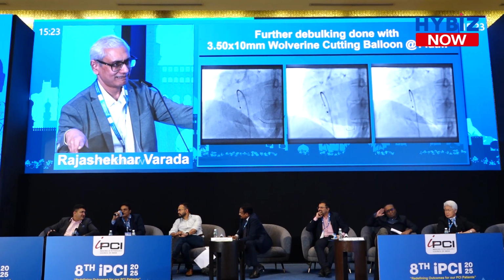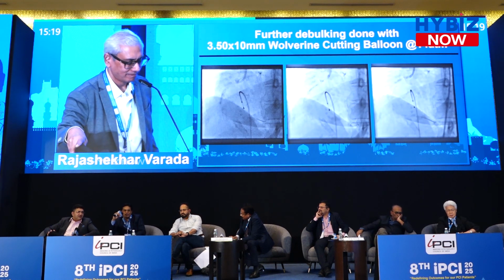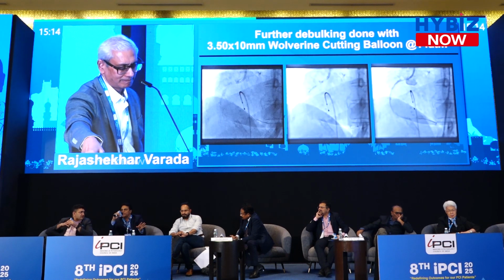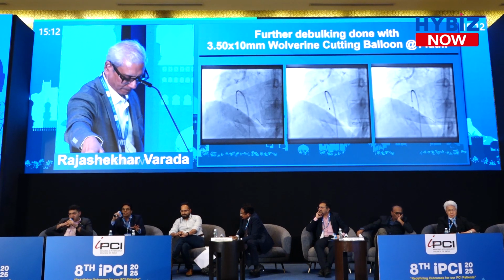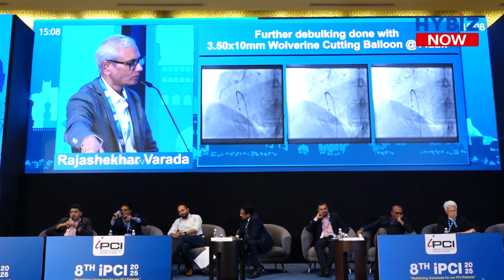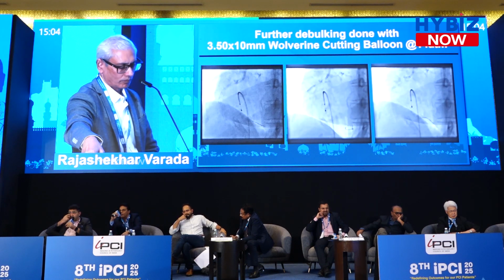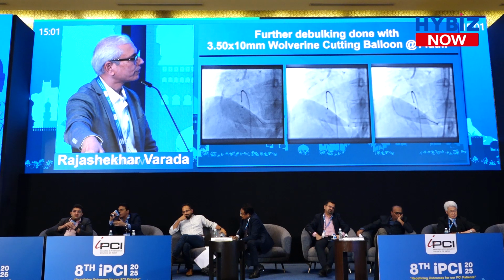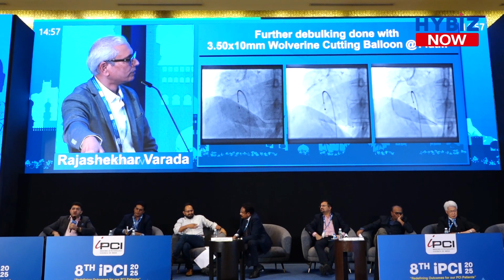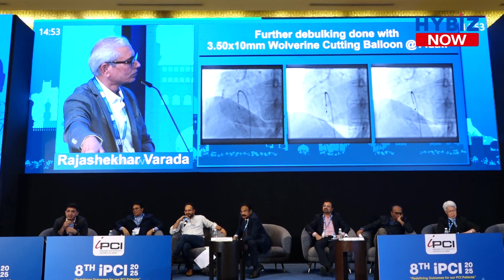So the imaging criteria went to upsize or escalate the modification strategy. If the thickness is more than 0.5 mm, if we don't see any cracks anywhere, then that is the indication for upsizing the burr or going with IVL. But I could see the wonderful cuts even with rota. I personally feel even without IVL, this case could have been done. So I strongly feel, I think we should take comments of Ajay sir.